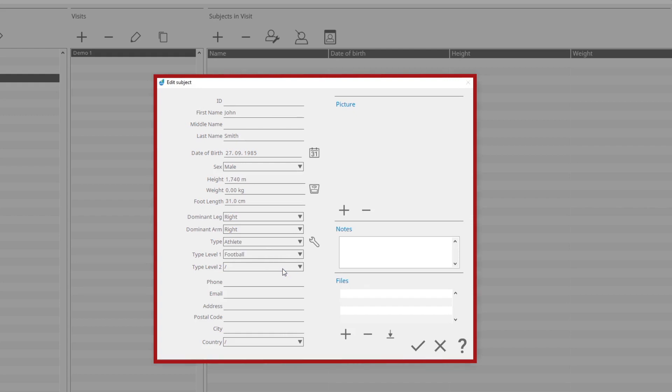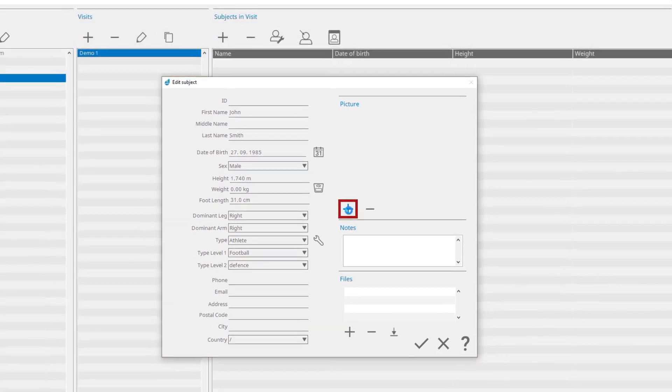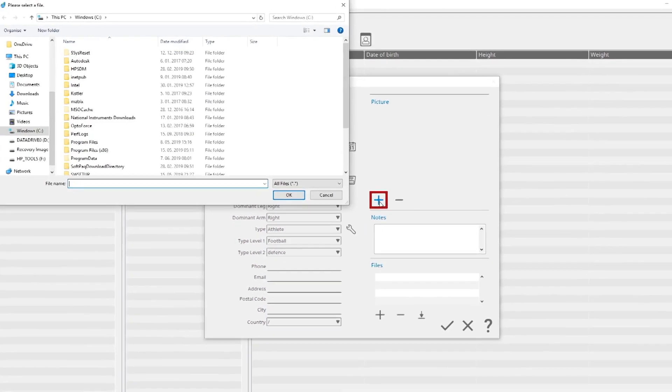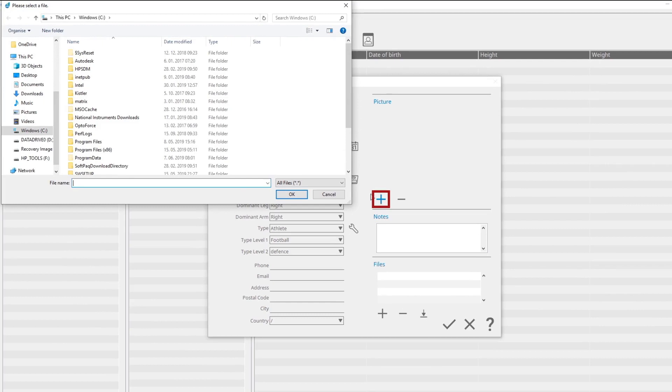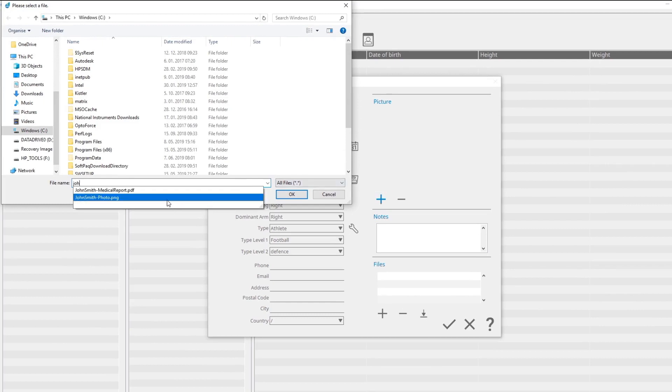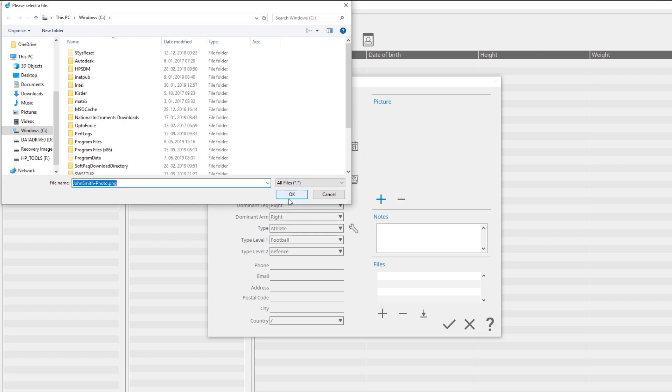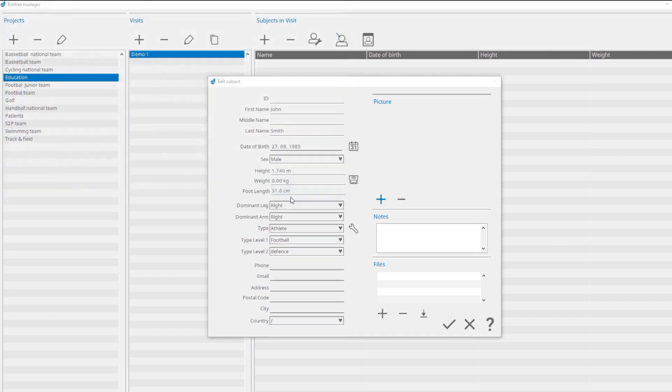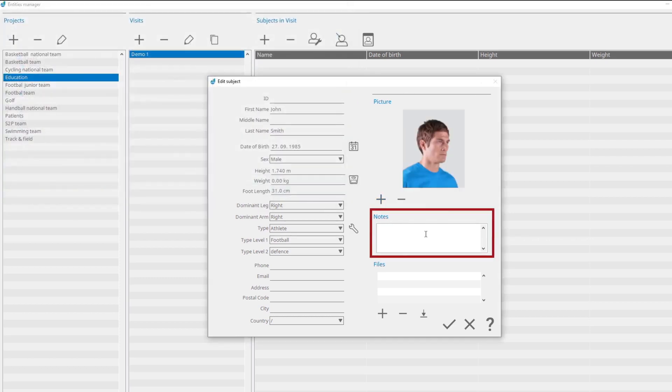You can also add a picture of the subject by clicking the Add Picture button. Select the picture that you want to add. You can write additional notes for the subject and load various files.